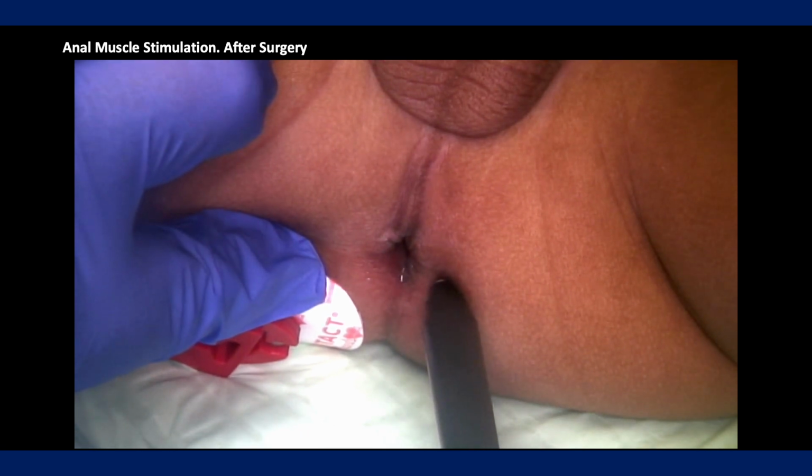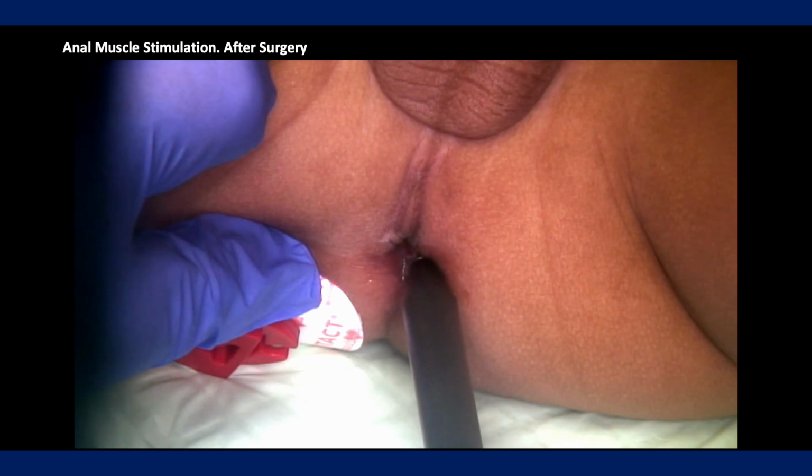The anal canal was adequate, allowing a size 12 Hager's dilator. Anal sphincters were also nicely placed around the anal canal. The baby later on continued to pass stools normally. However, he developed a perianal abscess that needed management. Currently, the baby is fine, is off the anal dilatation, and is taking normal feeds and passing stools normally.